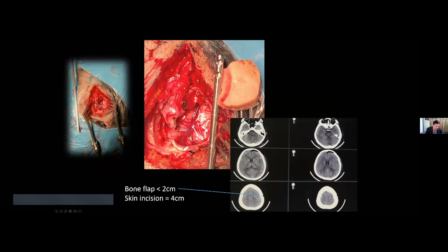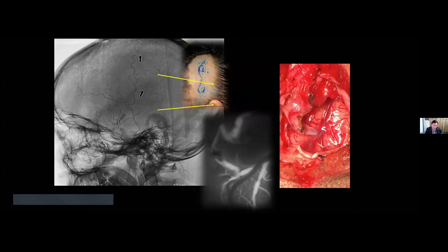The incision of the scalp is around four centimeters. The bone flap is smaller than two centimeters. This is after the surgery — you can see the very small hole. It is essentially a keyhole approach. The patient recovered very well. We kept the hair of the patient.